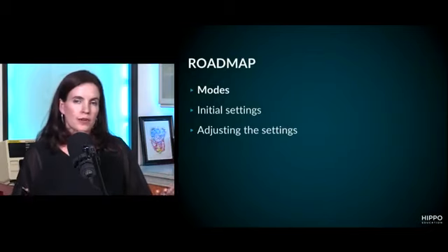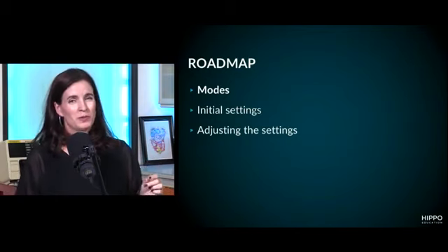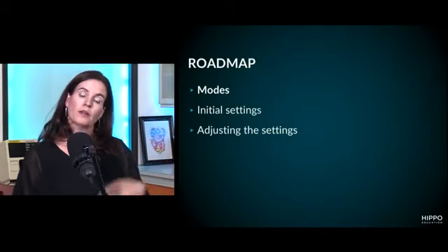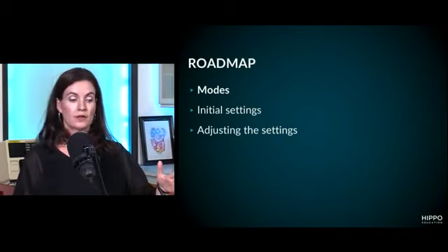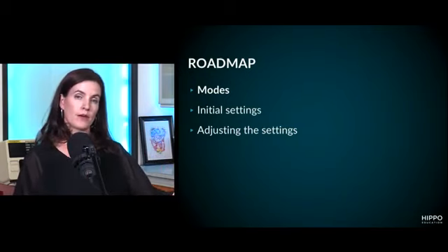Now, it's useful to have a bit of an overview about the ventilator, because when it comes down to it, ventilators are kind of stupid machines. All they do is blow air in. They don't even help you exhale. The patient has to do all that on their own. So when you're setting a mode, you're setting the parameters of that inhalation, which specifically is when it starts blowing air in and when it stops blowing air in.